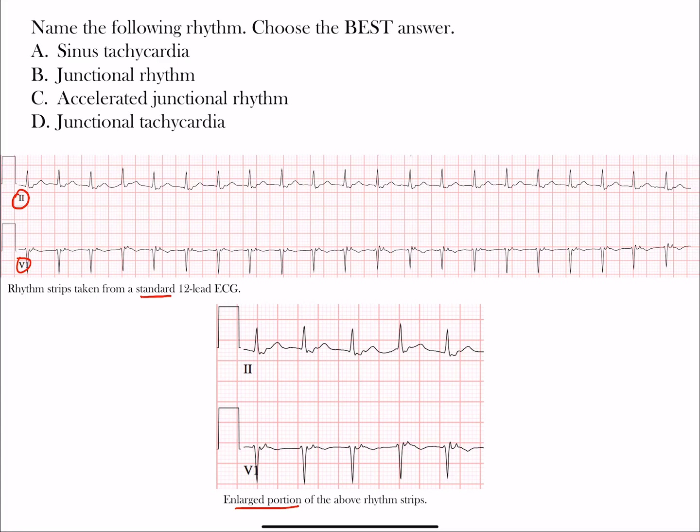Hopefully you had a chance to choose one of these four. Notice we have one choice mentioning sinus rhythm - sinus tachycardia. All the other choices are junctional rhythms in some form. To differentiate, with sinus rhythm you should see P waves.